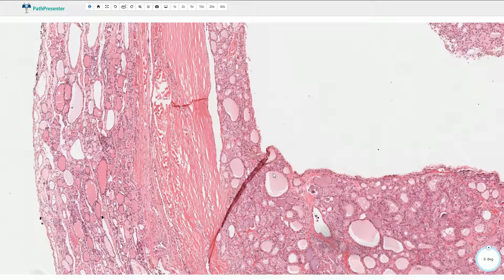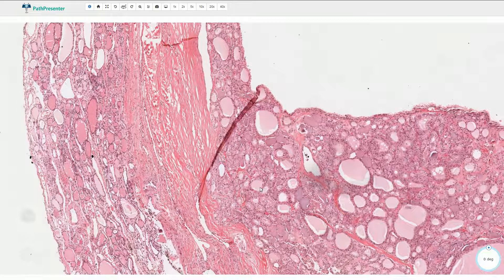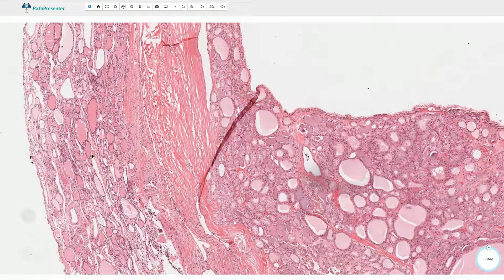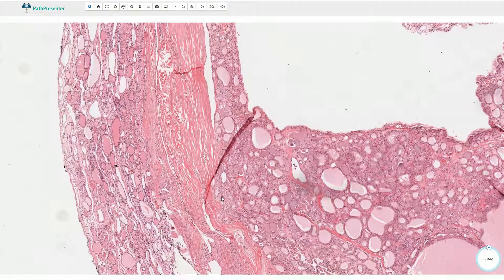Another important differential diagnosis is follicular carcinoma. Follicular carcinoma can look exactly the same as follicular adenoma; however, it is associated with an invasive type of growth. Either we can find invasion through the capsule, or we can find angio-invasion. Therefore, follicular adenoma needs to always be completely embedded and the capsule needs to be thoroughly examined to exclude invasion.